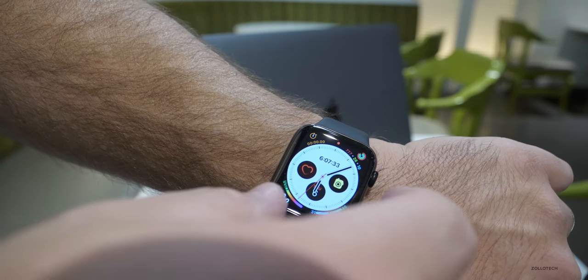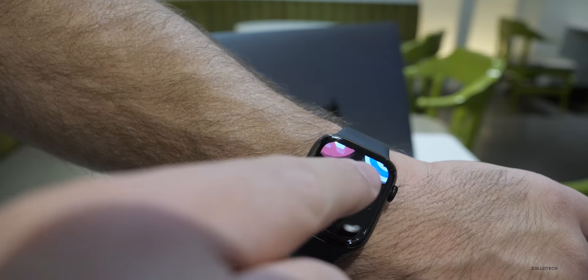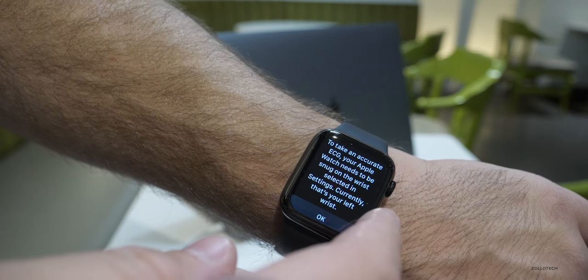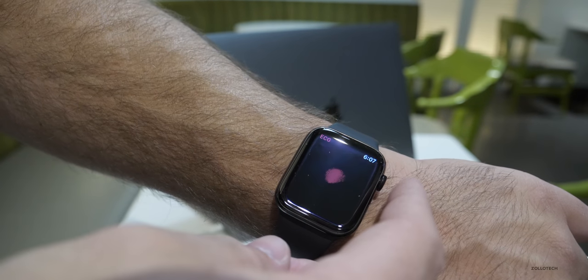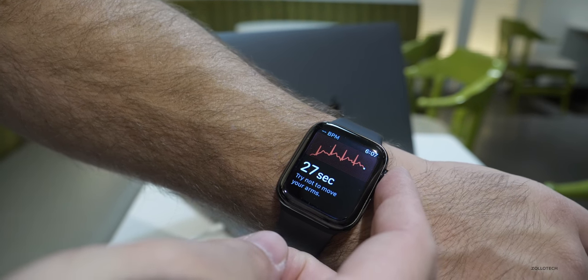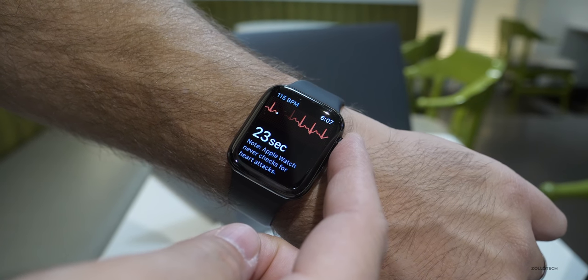If we open the watch app, what you'll see is if we click the digital crown and scroll down, there's a new ECG app. Let's tap on that, and it's going to explain how to actually take an ECG. We'll hit OK, and then we're going to put our finger on the digital crown and leave it there for about 30 seconds. We'll wait for this to run and see if it comes back with anything.